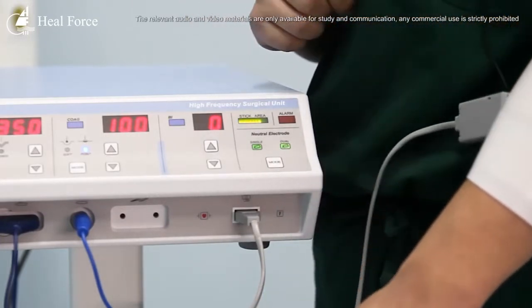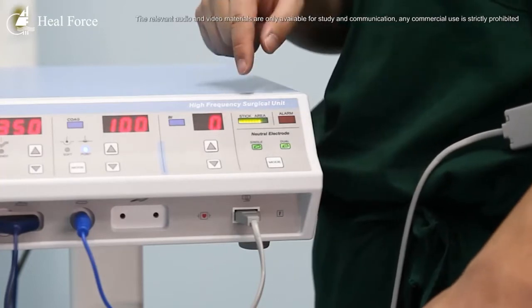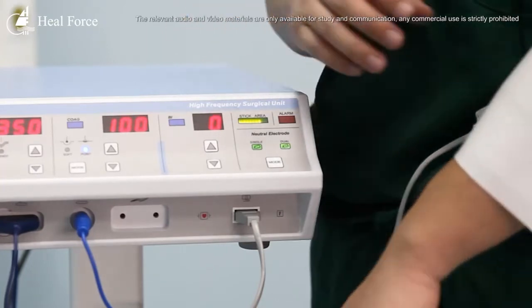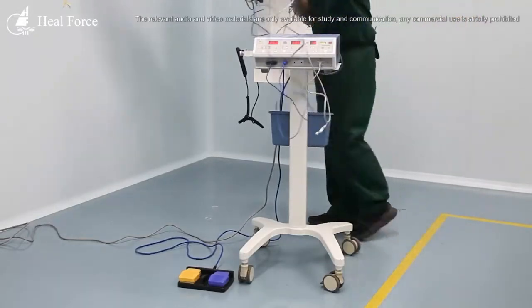This alarm indicates you cannot continue surgery because it can cause burning to the patient. Now I'll show you how to use this pencil.